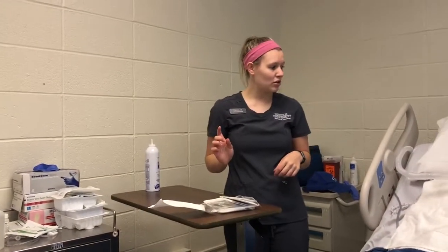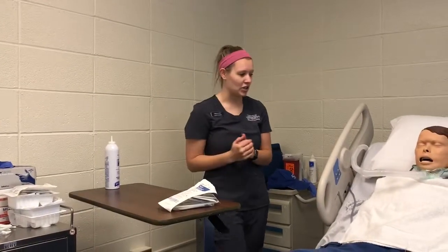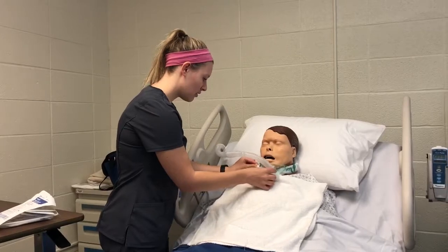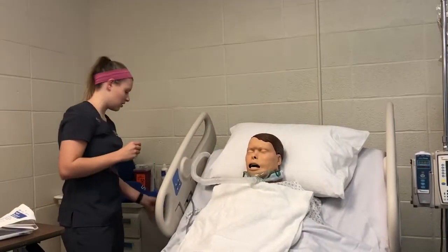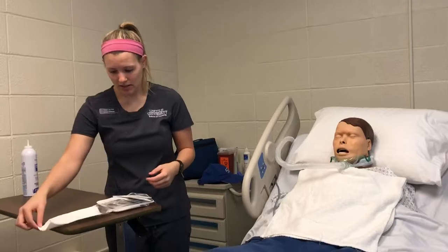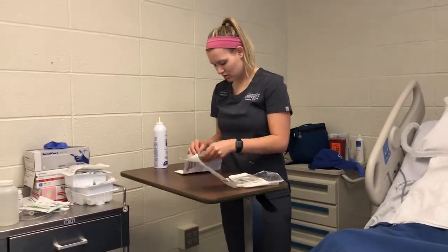And another thing I want to do, actually before I would open this, I wouldn't even open this yet. I've done hand hygiene. I'm going to take off this gauze sponge underneath my patient's trach, just so that's out of the way because it's soiled. And then, okay, so now I'd get into my sterile suctioning kit. I would put on my sterile gloves.